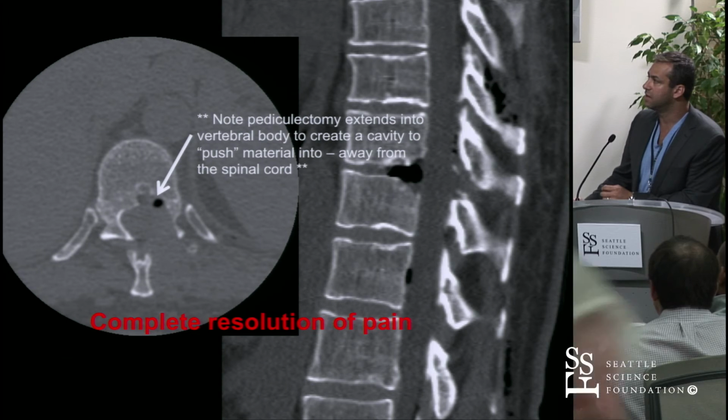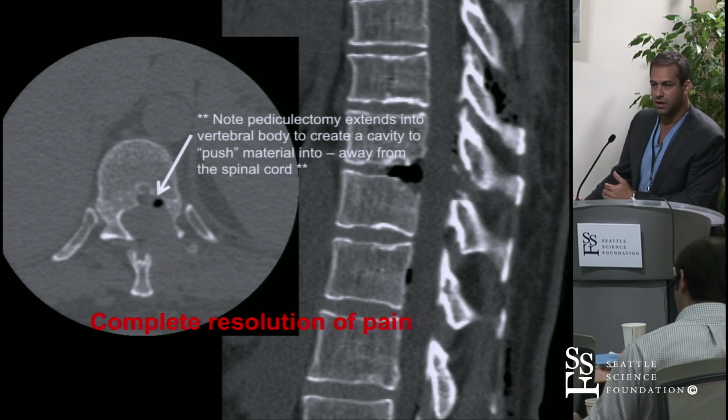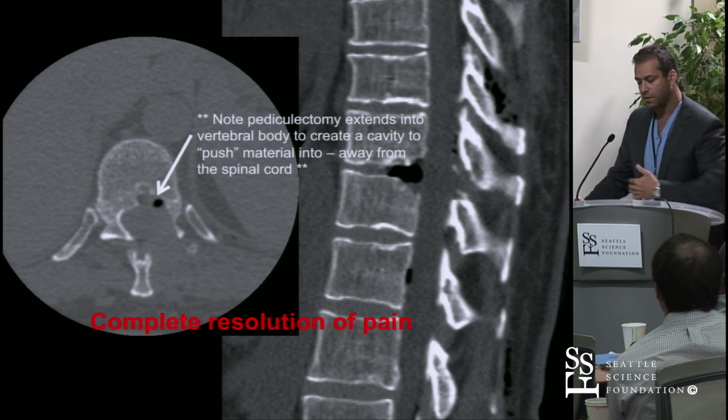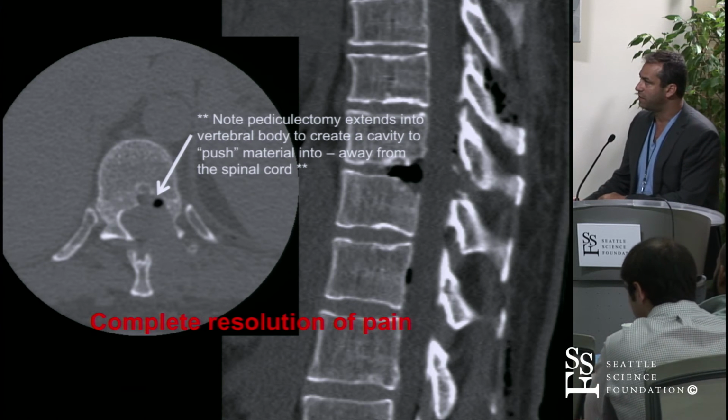And the point being is that you never want to manipulate the disc material that's abutting the cord. You always want to move it away. You never want to pull it towards the cord. You always want to push it away from the neural structures.